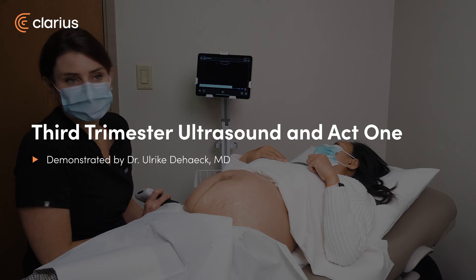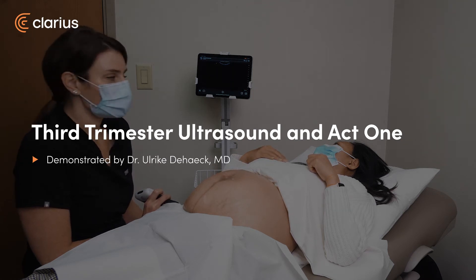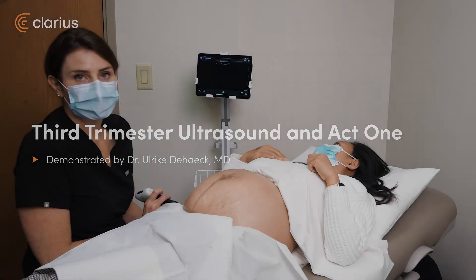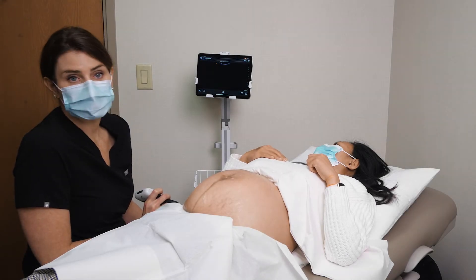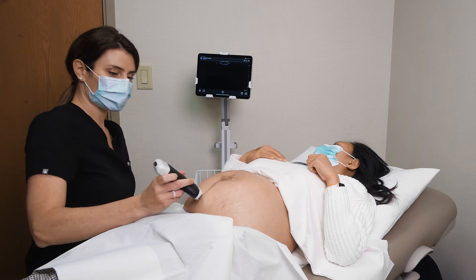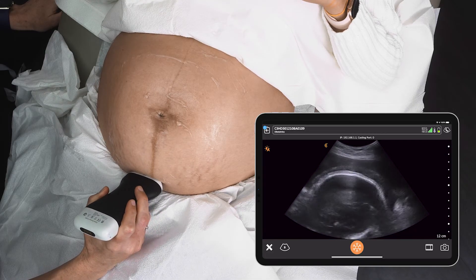We have a patient in our third trimester and we're going to scan through looking at fetal position, heart rate, and try to get a profile photo. We'll take some videos and photos and actually be able to send them to the patient after our scan. Baby is cephalic, head down.